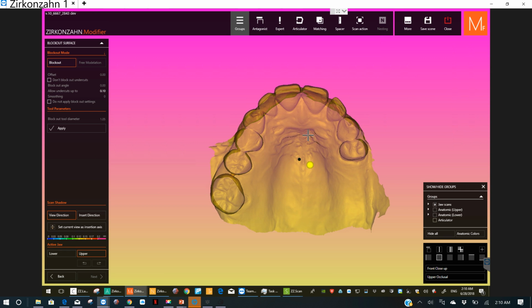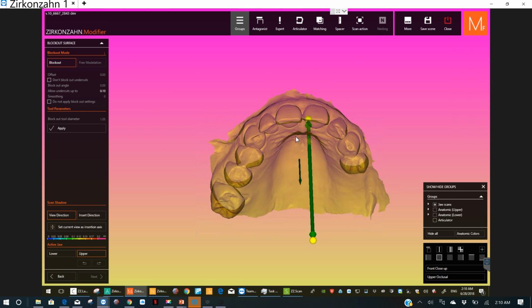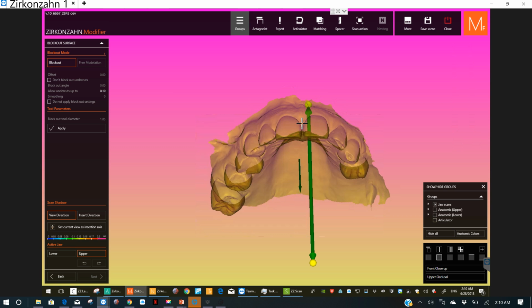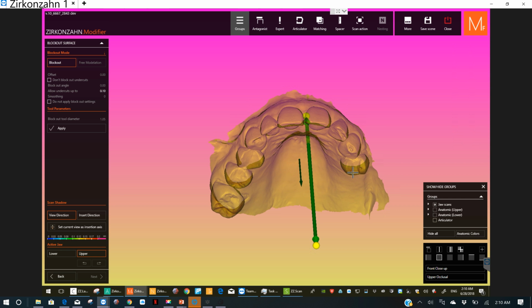And you have to decide which way you want the thing to slide on. So I'm going to move this until it looks like it's... The main thing I want is I want this to be nice up at the gum line on the outside. So I need to be able to see this margin cleanly everywhere. And it shows you how much undercuts you'll have in other areas, so we'll have a little bit of a problem there, but I don't care, that's in the back.